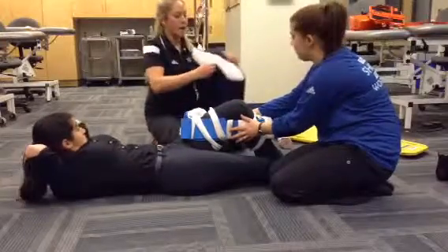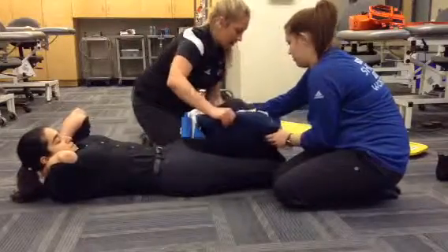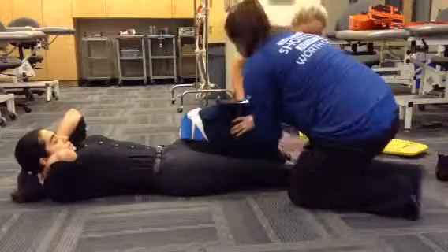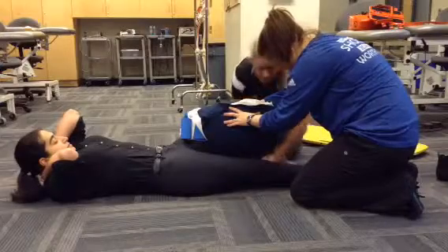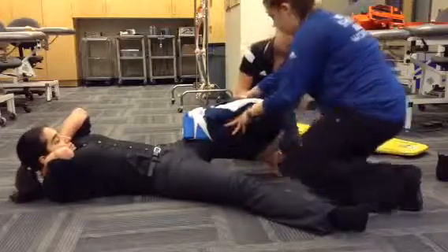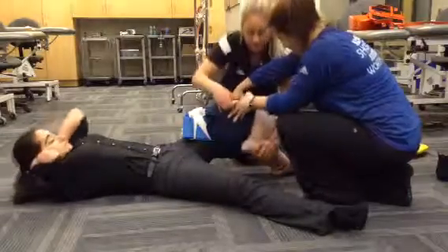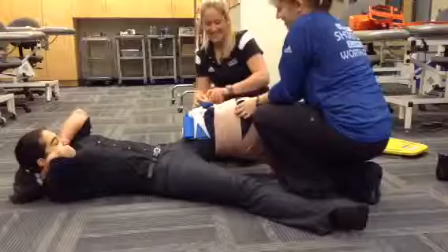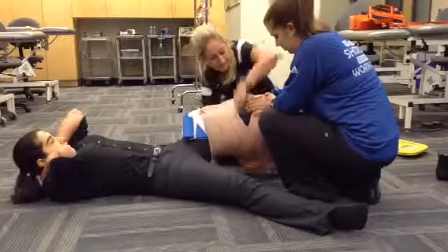Next we're going to add a pillow for extra support. We're going to come underneath, and the partner is going to stabilize around. Using a tensor bandage we're going to apply the splint, starting at the foot. I'm going to avoid the dislocated patella and come across in a V.